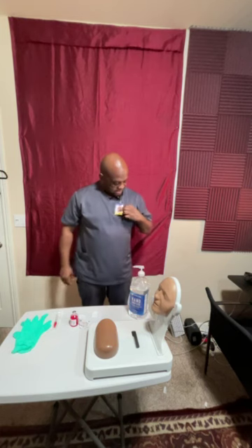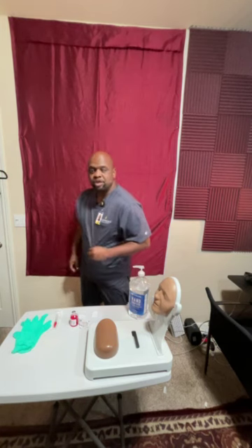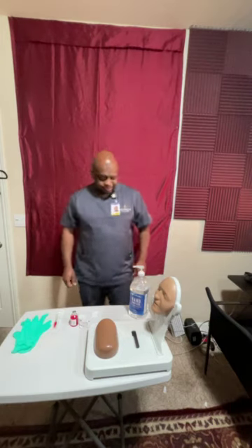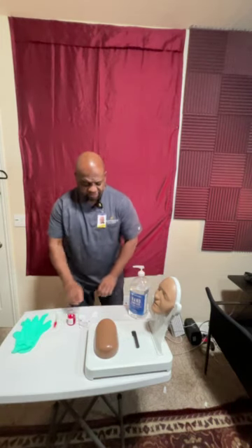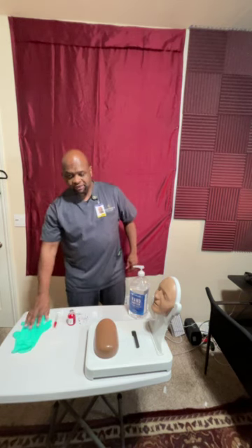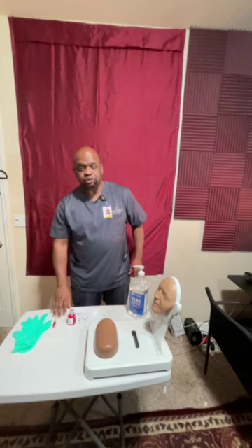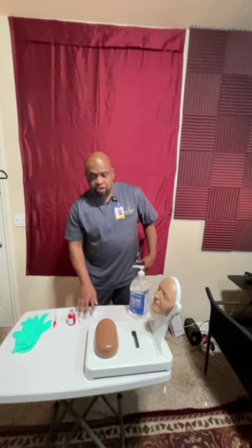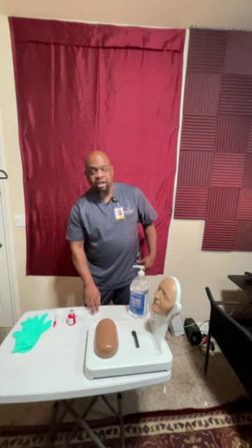Today I'm going to be doing a video skill of an intradermal injection. I'm wearing my ID badge. I'm wearing my school scrubs, uniform name, and including the shoes. First things first, let me just point out some of the things I do have here. I do have my gloves, my syringe, my tuberculin syringe. I do have the alcohol wipes, and I also have a gauze, right?